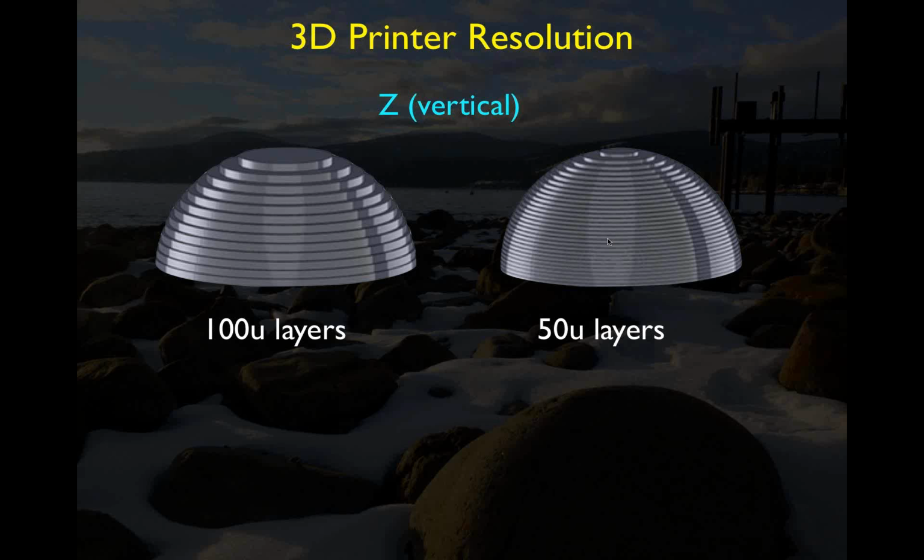And so since each layer takes about the same amount of time to cure, at least in a DLP type of system, then this would obviously take longer, but give you a better result. So deciding how you're going to utilize this in your lab is another thing that we will talk a little bit about. And one of the things that can help you speed up a print, depending on how fine you need the resolution or the edge or the surface to be, how smooth.